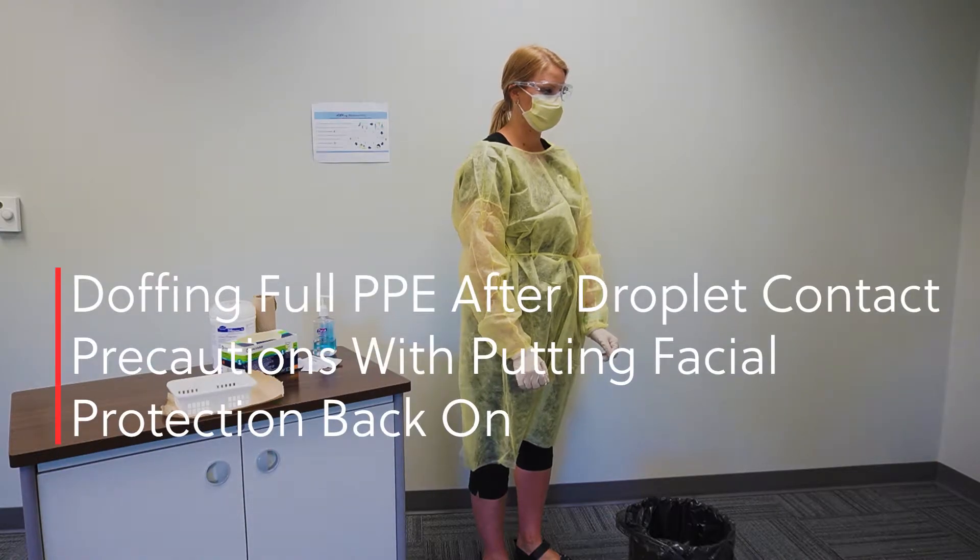Doffing full PPE after droplet contact precautions, with putting facial protection back on.